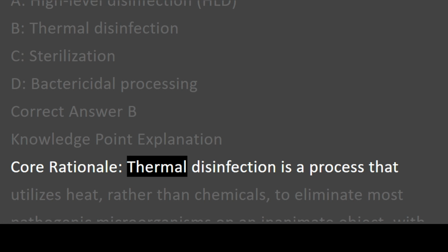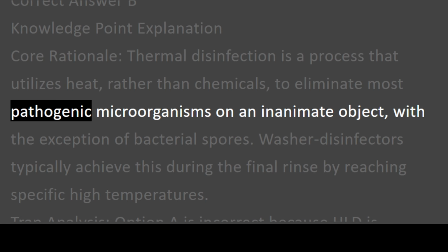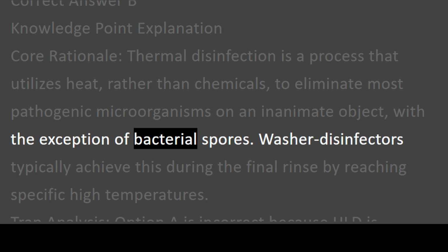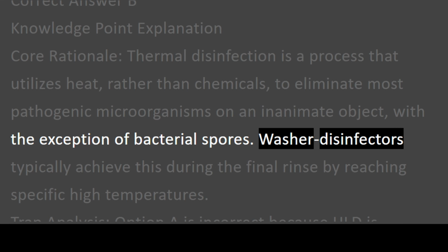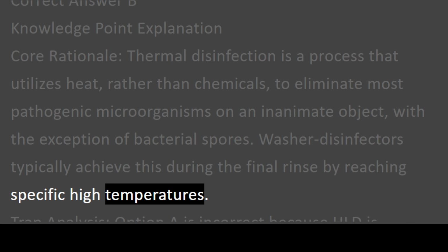Core rationale: thermal disinfection is a process that utilizes heat, rather than chemicals, to eliminate most pathogenic microorganisms on an inanimate object, with the exception of bacterial spores. Washer disinfectors typically achieve this during the final rinse by reaching specific high temperatures.